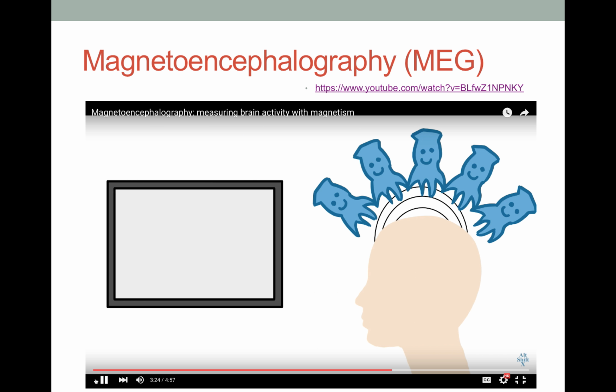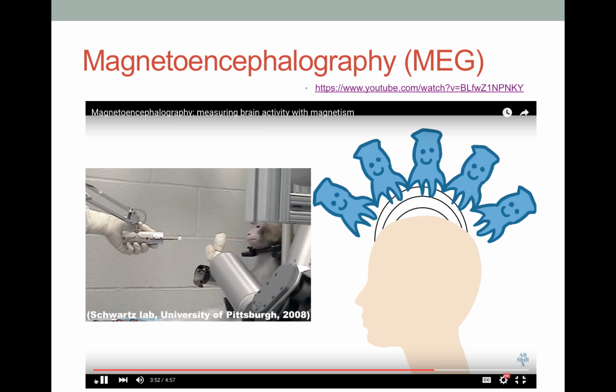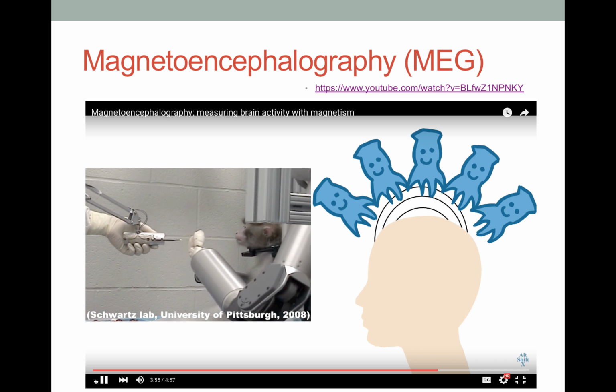Some of the really cool things you can do with MEG include brain-computer interfaces, where a computer can monitor and respond to brain activity. In one study, a computer was set up to move the cursor on a screen when a particular kind of brain activity was detected by MEG. Stroke victims who couldn't move their hands learned to produce that kind of brain activity. They were able to move the cursor with their minds. When the computer was connected to a mechanical hand, the stroke victim could open and close the hand with their brain activity. Similar stuff has been done with monkeys controlling robotic arms.